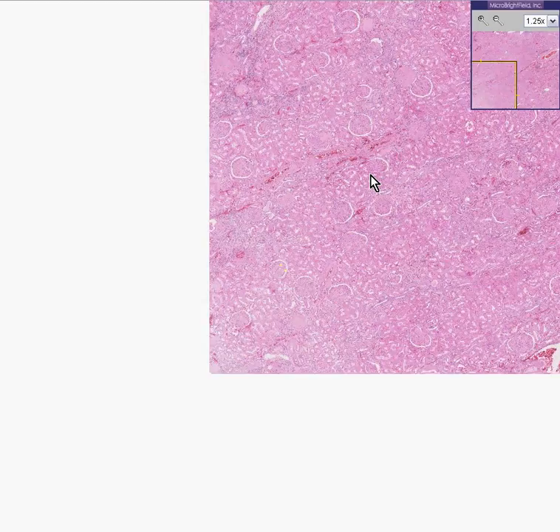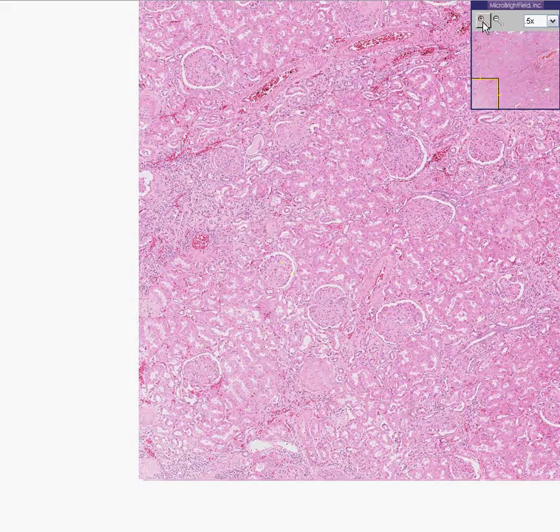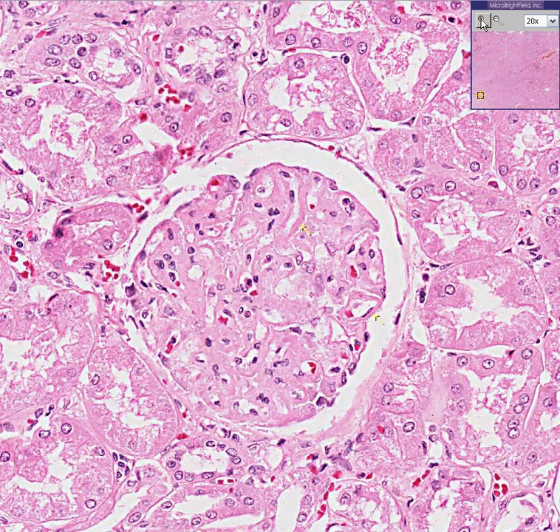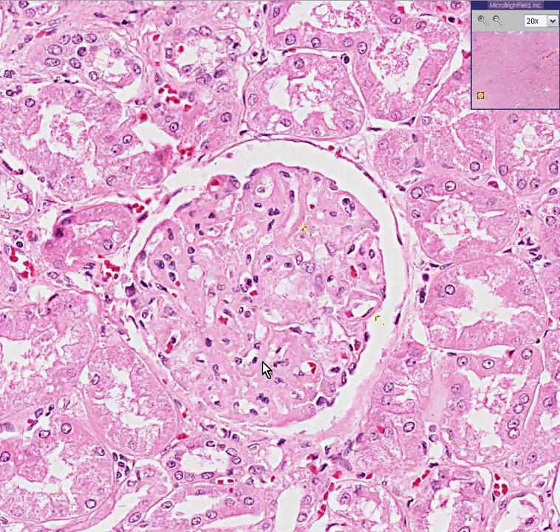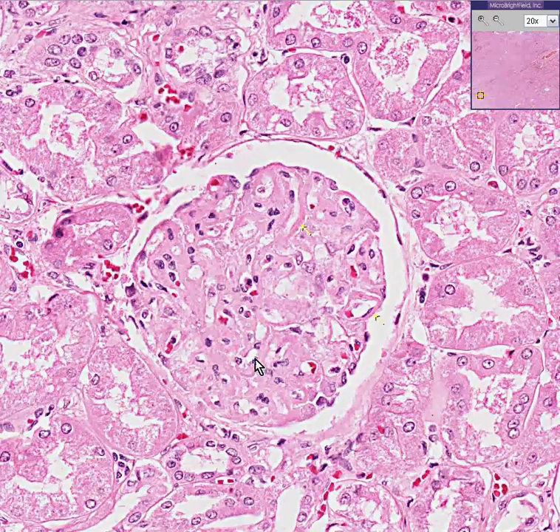Here is a classic type of change noted in the kidneys with lupus. Notice as we go closer and closer into the kidney, you can see that the glomeruli appear to have a lot of thickened material in the basement membrane. It looks like the spaces between the capillaries are affected.